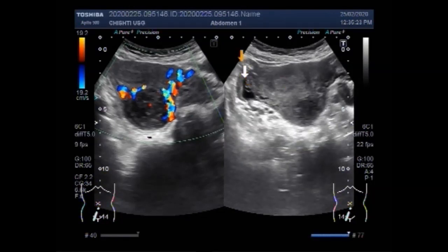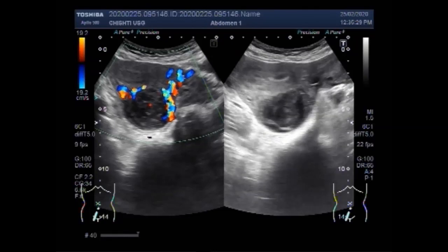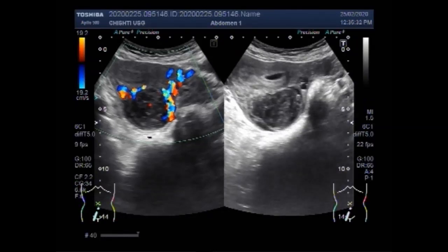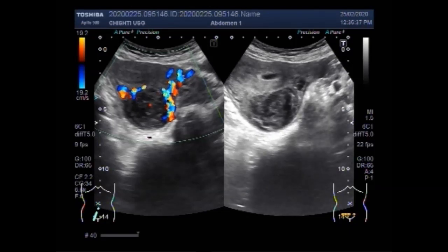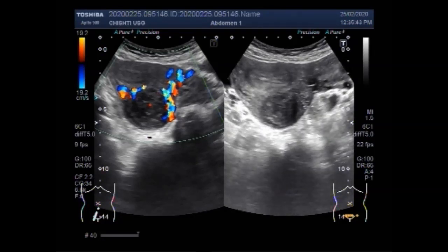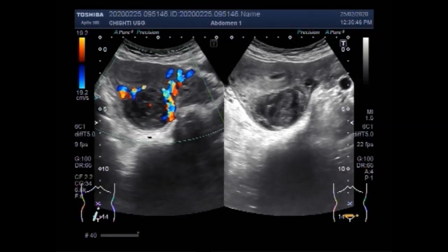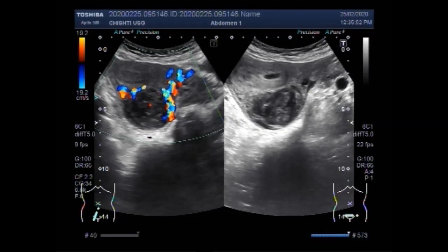You can also see the left ovary. The mass is clearly seen in the middle portion of the uterus along the posterior wall.